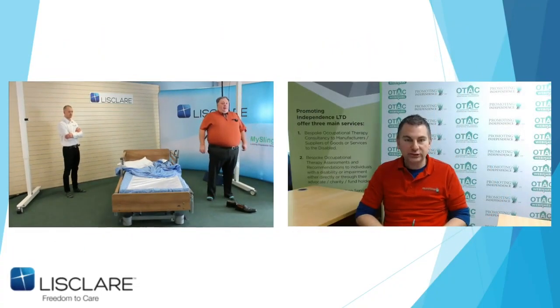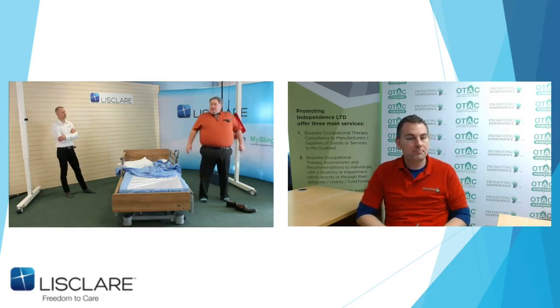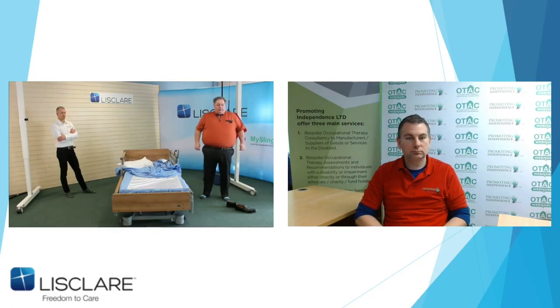Right, Stuart, you're giving me a workout today. Yeah, lots of questions. One of the concerns we've had is what about the head? They didn't see you supporting the head at any time. Would you increase pillows for that? To be honest with you, if you use the top sheet and the pillows, my head was not going to go into an extensor spasm. This is one of the hassles of doing it online. You'd love about 3 more cameras where you could see this, but I'm not lying back in that position. If they were worried about that, I remember doing a supine lift with a patient that if her head went back at all, there was a risk of cardiac arrest, and we just placed another cushion behind her head, but we lifted her in a similar way, and she came up in a perfect position.